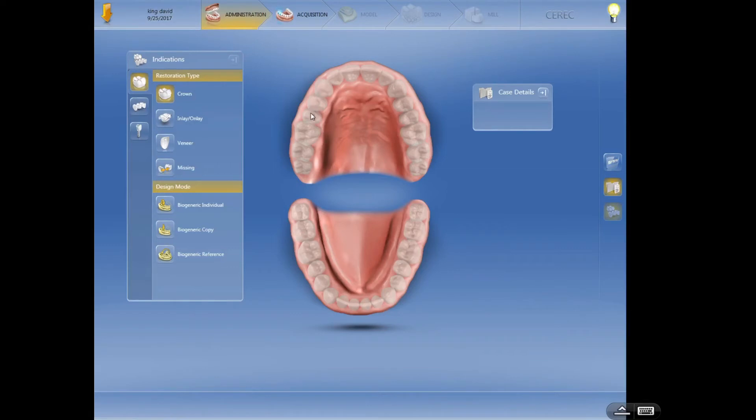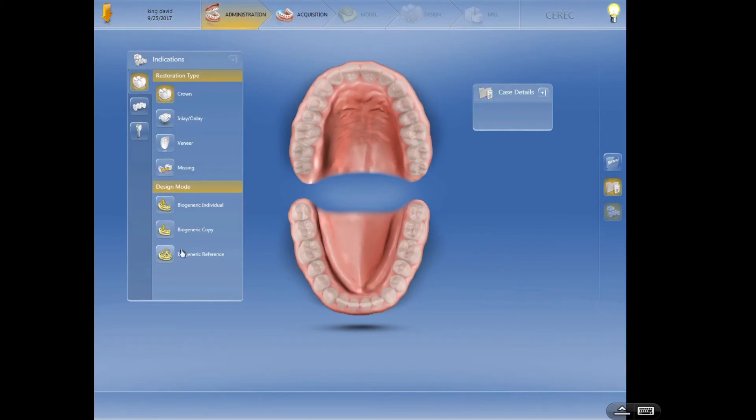This is where you have a tooth that's pretty perfect and you want the computer to use it when it's considering the design. I don't use this much. I used to use it a lot, but I don't use it much now that the biogeneric individual is so powerful.